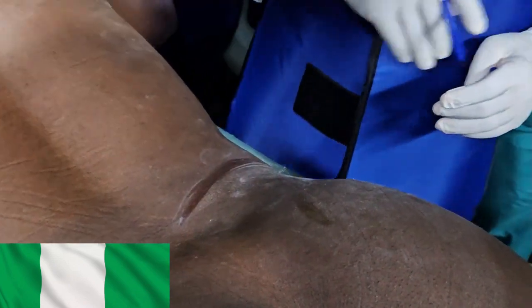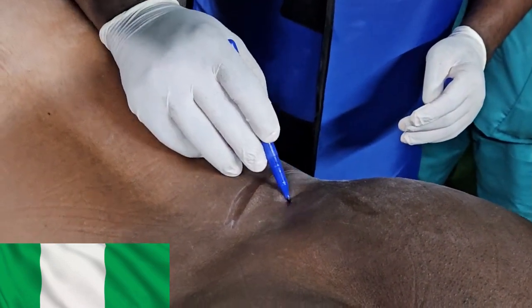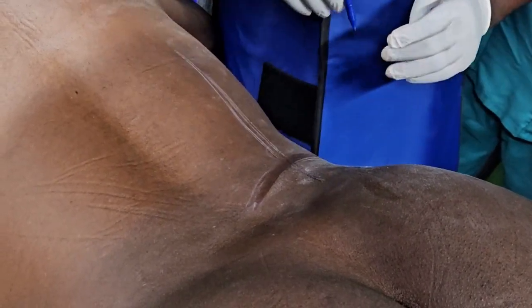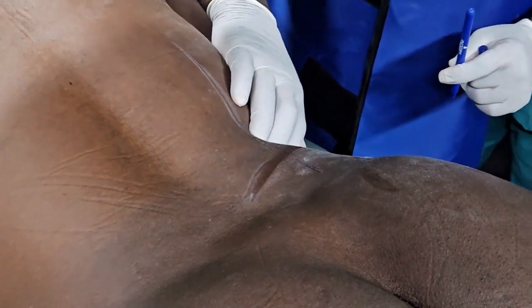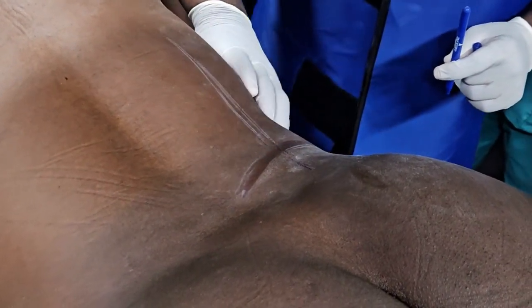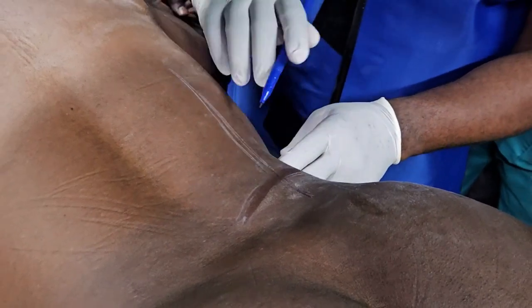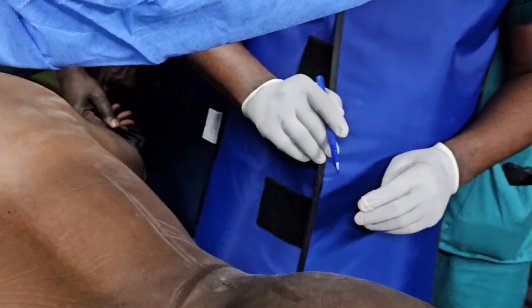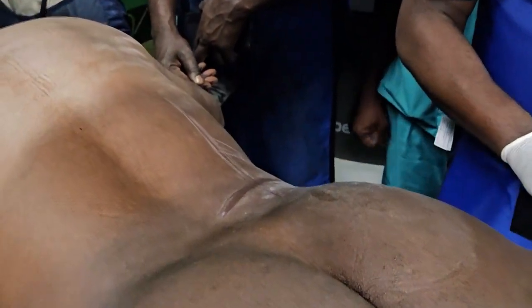Okay, so the paraspinous muscle, this is where you have it. Sacrospinalis. So then the 12th rib, very important landmark. Okay, so this is the 12th rib. So then the posterior axillary line.